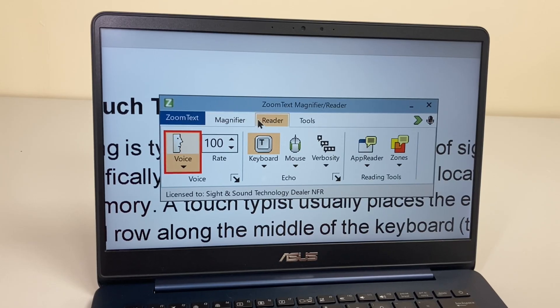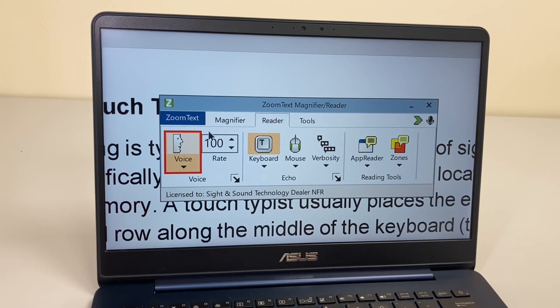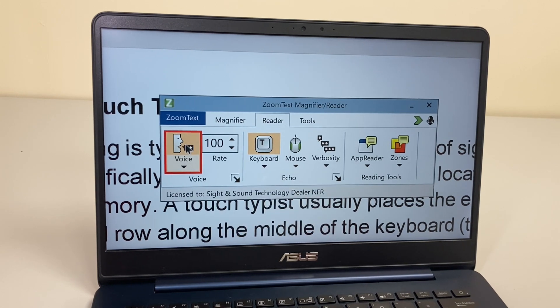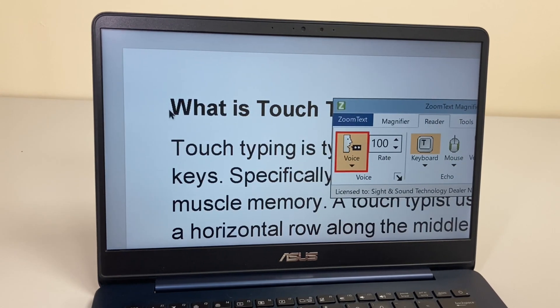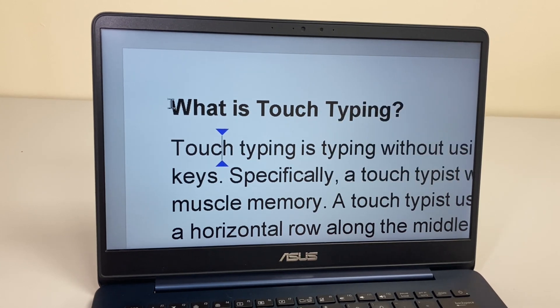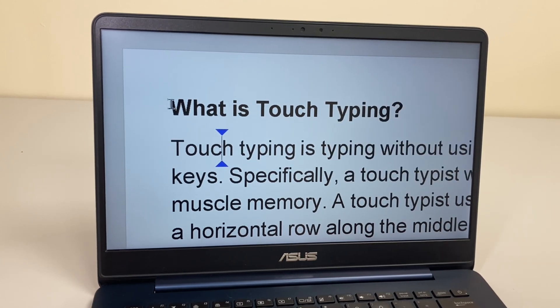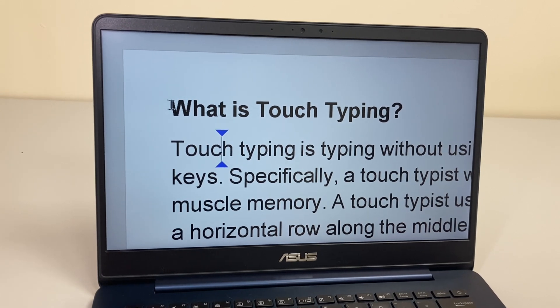Now we're going to look at the voice and reader functions in ZoomText Magnifier Reader. If I switch the voice on — voice enable — and go to a document I have in the background, I can then arrow up and down. It will read the document to me: 'What is touch typing?'